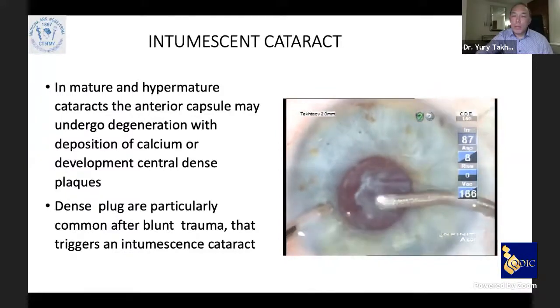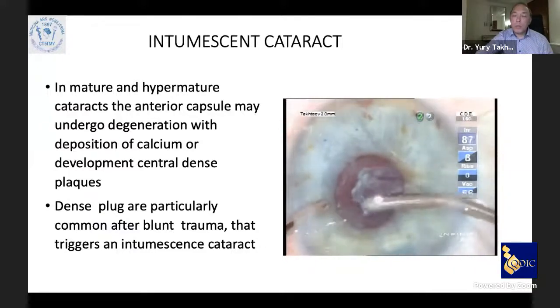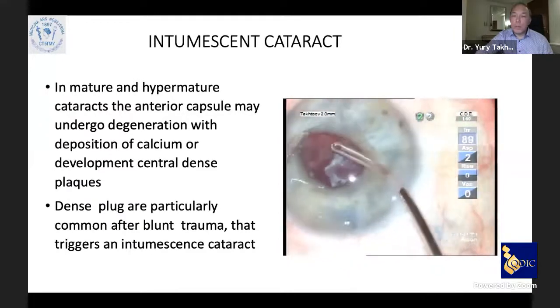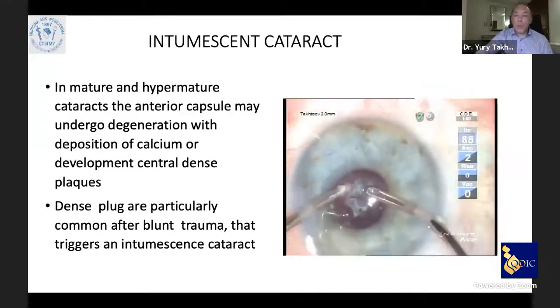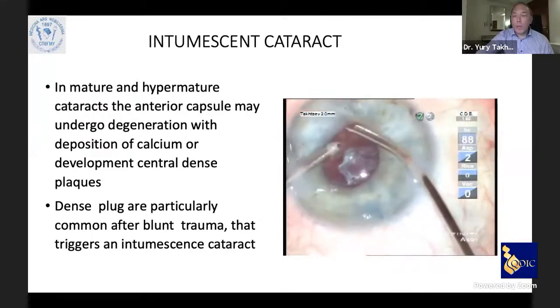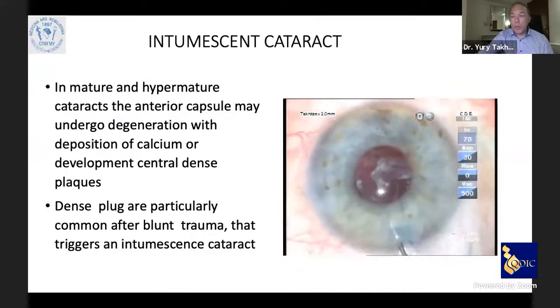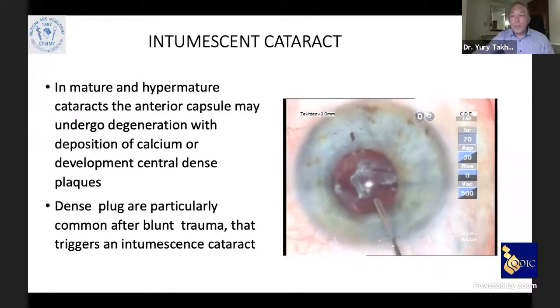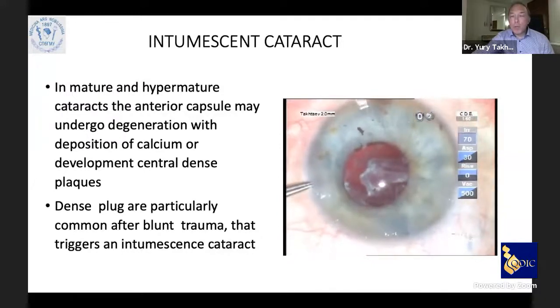This is a traumatic cataract with subluxation, and then capsule fibrosis, anterior and posterior capsule fibrosis. So there is no material in the periphery, and now we can focus on the posterior capsule. We can't open the capsule the normal way, like from the posterior axis, because the fibrotic tissue goes to the periphery, so you can't control the opening. And we decide to remove the fibrotic tissue and try to separate it from the capsule.